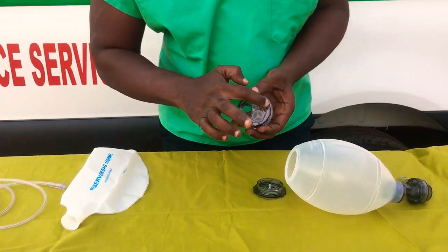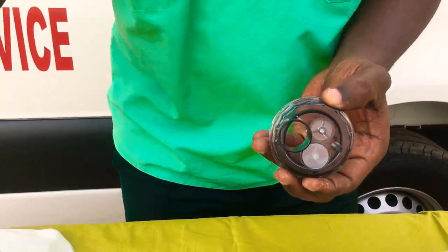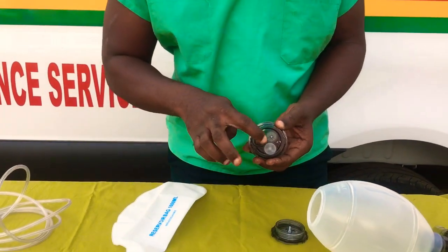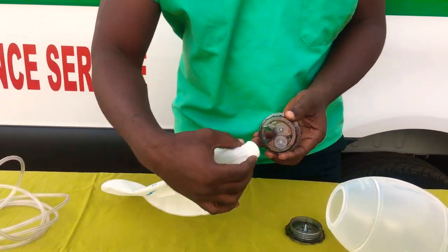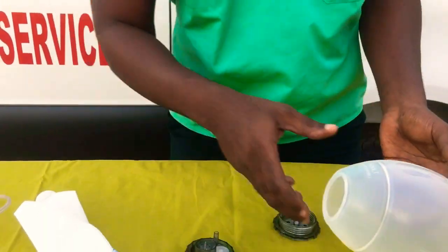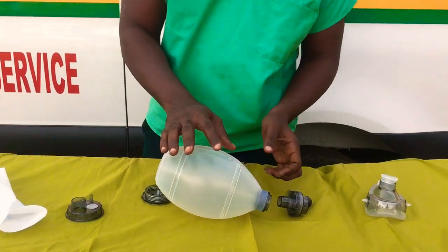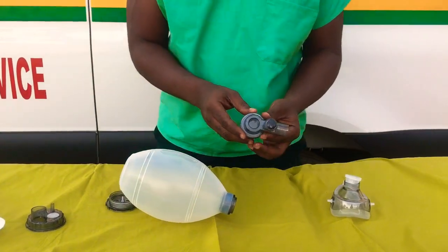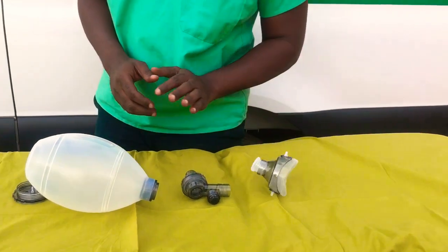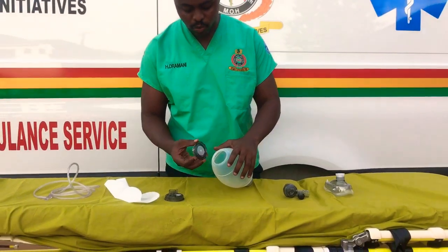We realize that we have two holes over here. The smaller hole is what we call the oxygen inlet, where this oxygen connecting tube will be fixed. And then this is what we call the air inlet, where we can also connect the reservoir. This is the self-inflating bag — we press and then it inflates on its own. And then this is what we call the pressure regulatory inlet. And then this is the mask.